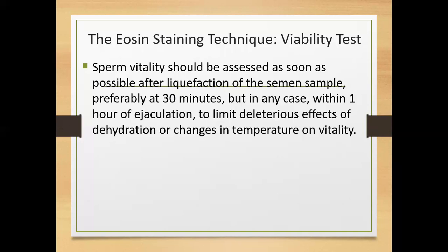Just as we are talking about the fact that your stain should not be dissolved in water. If you didn't know, you may ask somebody to give you stain which is already prepared. The person prepared it, not for a vitality test, and used water to prepare it. Then you just go for it without asking about the base of the stain. Then you are going to kill all your sperms and then report a high rate of dead sperms.